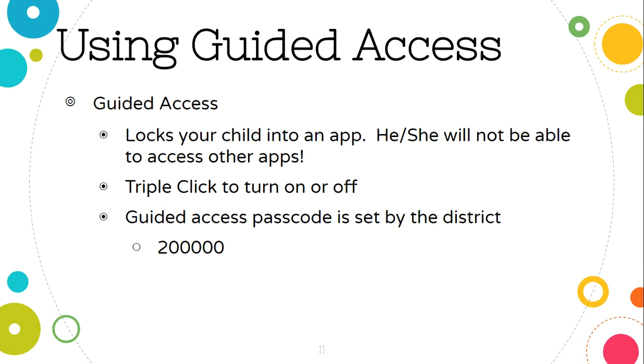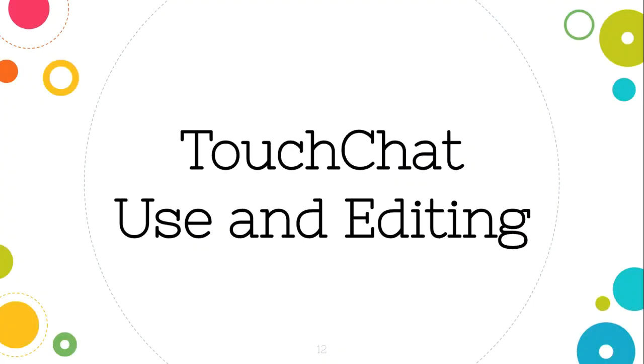So again, here's your passcode, should you need to use that. So now we're going to talk about editing. So the first thing we're going to do is watch a short video on editing using TouchChat.